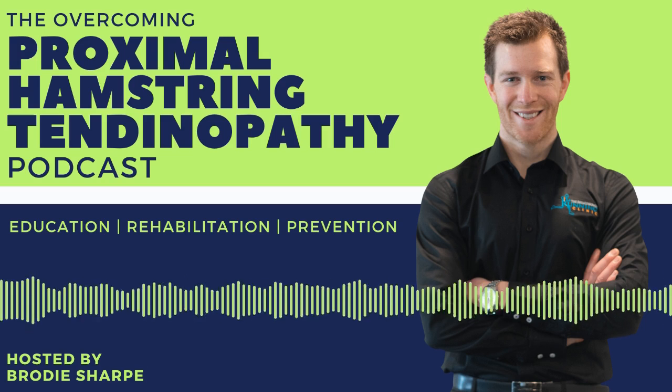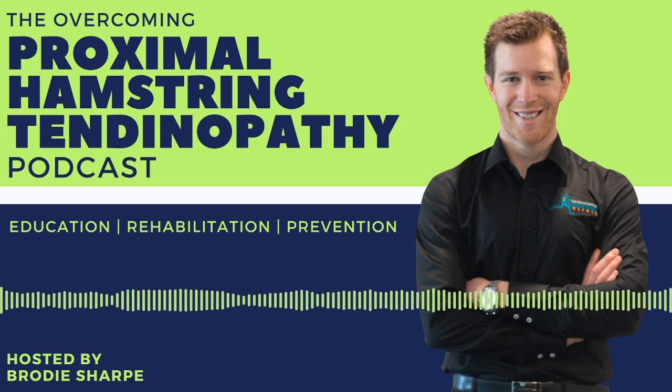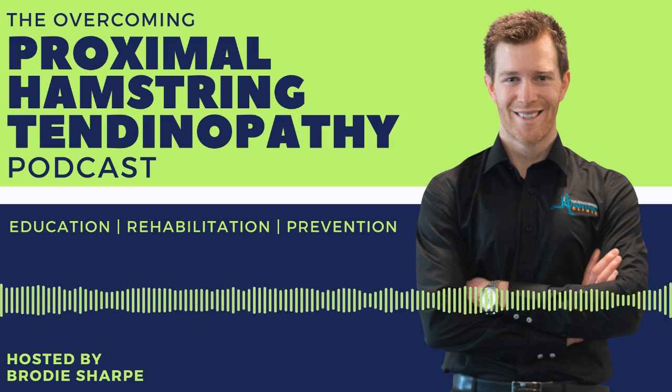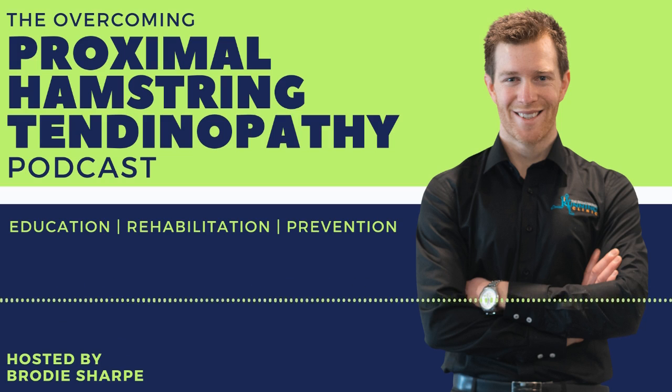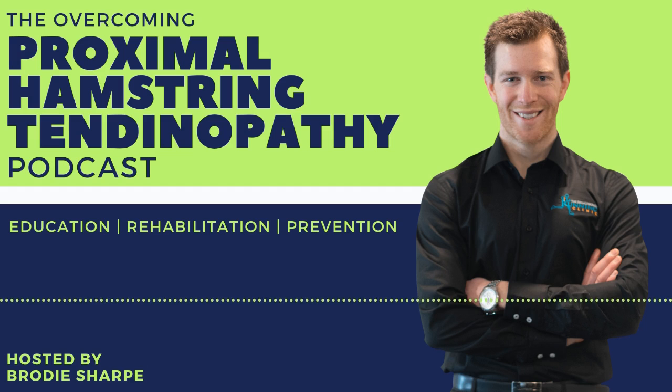So from my experience, and I think the literature also supports me, my key areas where I would start, for somebody starting on the Shockwave journey, even for a runner, what are the areas where you might get a good result? It will be heel pain, definitely plantar fasciitis, Achilles, both mid-portion and insertional, patellar tendon, lateral hip, proximal hamstring tendinopathy. That's pretty much it. And I do treat a lot of groin patients with adductor tendinopathy as well, which might not be relevant for runners. So those are the areas where it's very reasonable to try Shockwave, especially if they failed with good quality rehab.